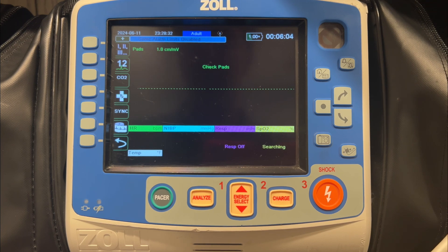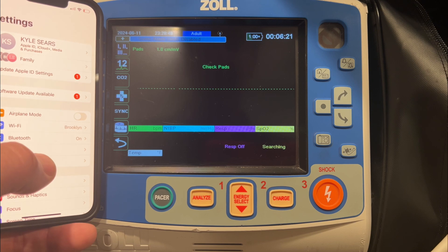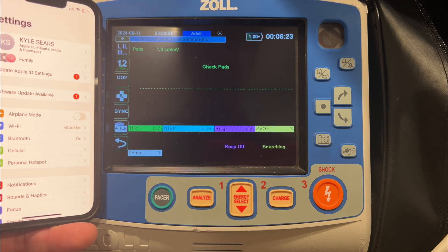With iOS, it's important to understand that it works via Bluetooth. The device and either the phone or tablet — an iPad in this case — are going to connect via Bluetooth and then move data using the personal hotspot on those devices. The first thing to check is under settings to make sure your personal hotspot is active. If it's not, it doesn't have the ability to move data at all.